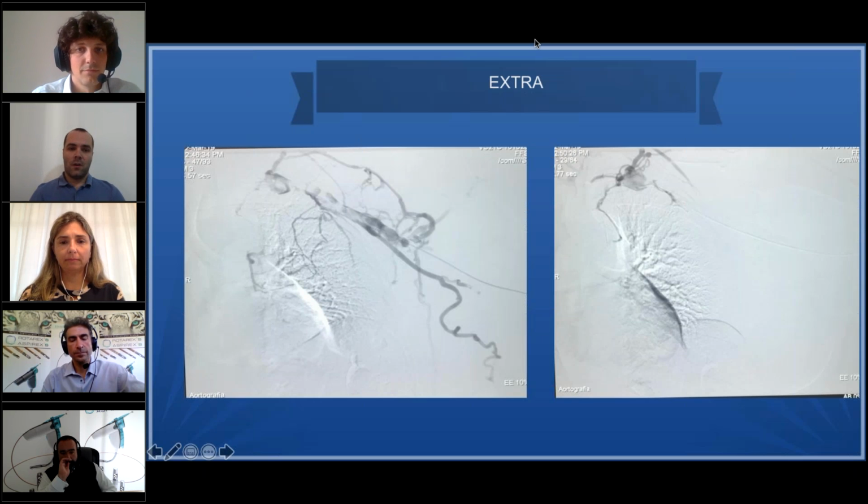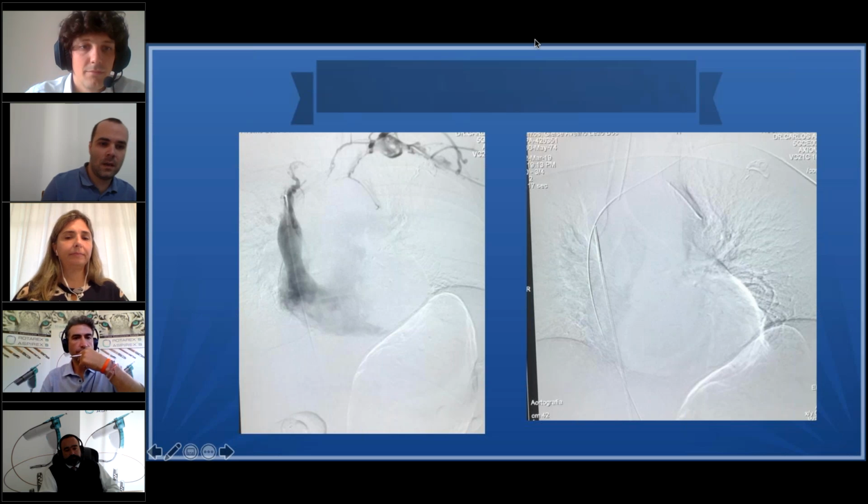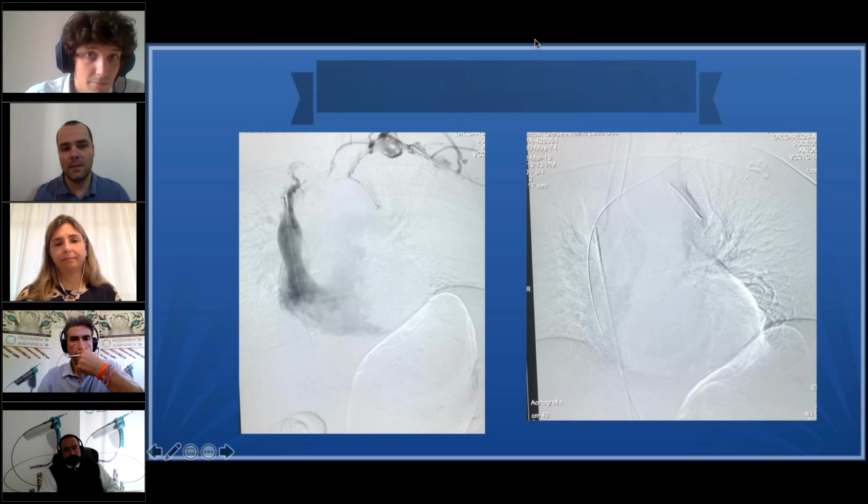At the initial angiography, you can see that on both the left and the right, you don't see the vena cava, you don't see the subclavian, the brachiocephalic vein anywhere. So that patient had no more access, not even the femoral vein or vena cava, nothing. I had to do something. When you see a very challenging case like that, you sometimes have to take a different approach.